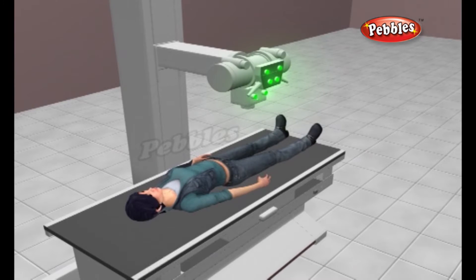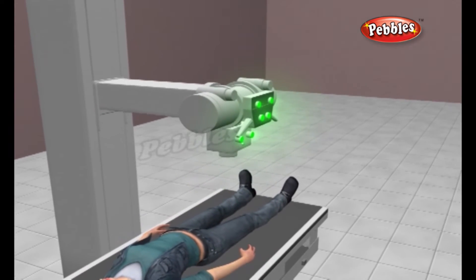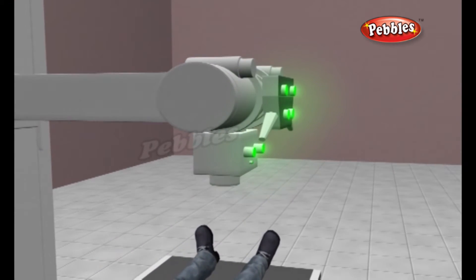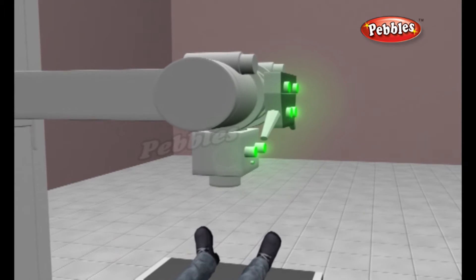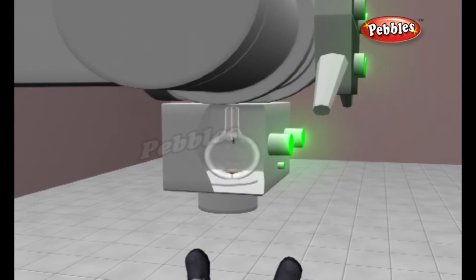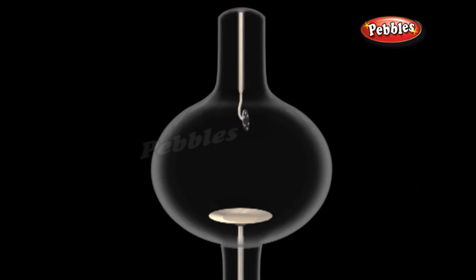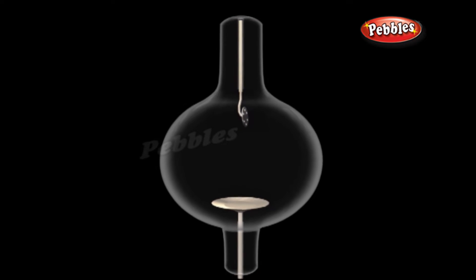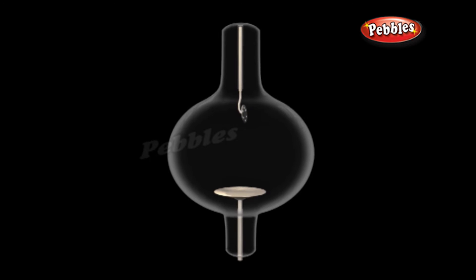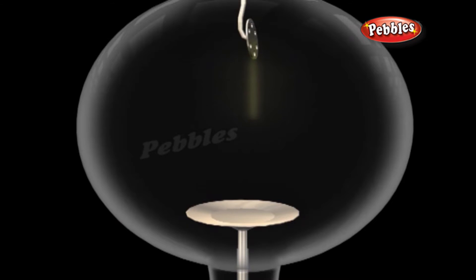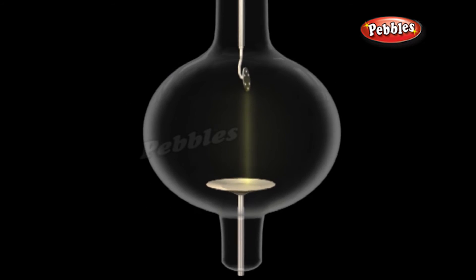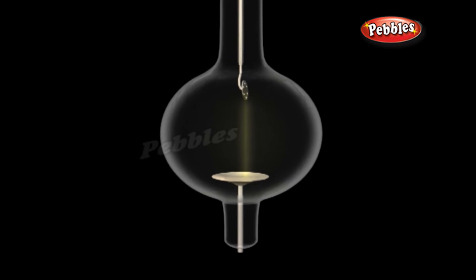The X-ray machine is composed of an X-ray tube that contains a pair of electrodes, or conductors, called a cathode and an anode. The cathode is a filament that releases energy with the introduction of an electrical current, much like that of a light bulb. The cathode energy is released in the form of electrons. The anode, located on the opposite end of the X-ray tube, is a disc made of tungsten, a material that attracts the electrons.